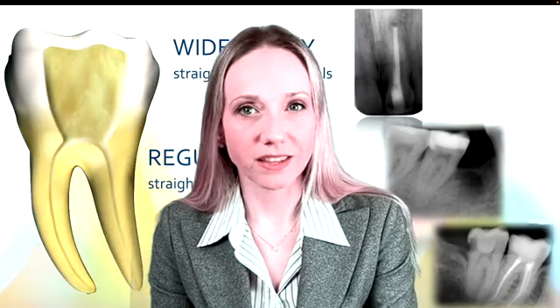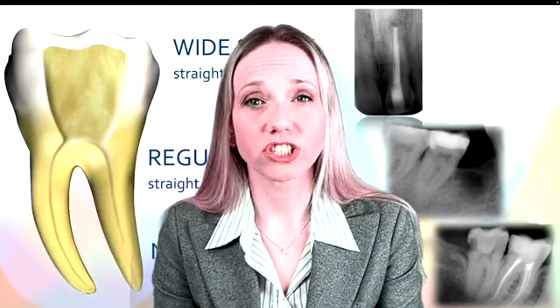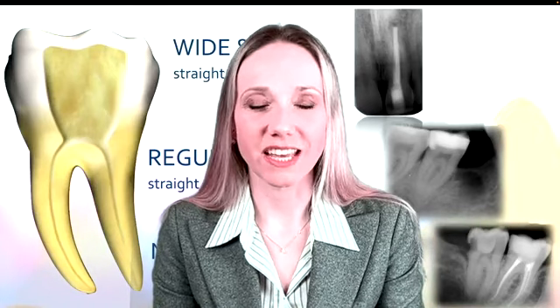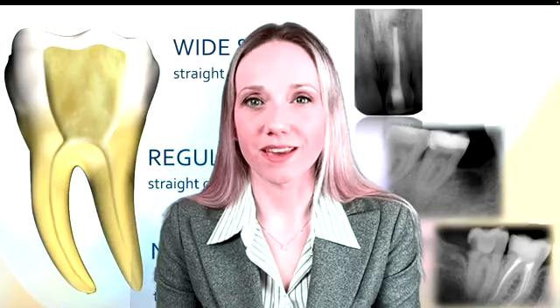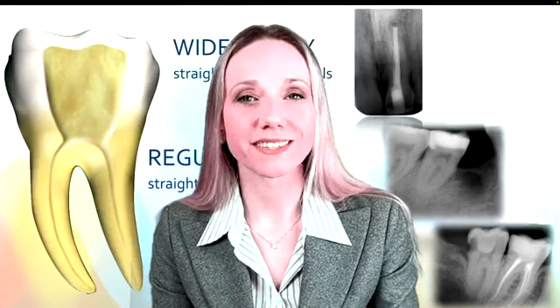in the outcome of our treatment and the outcome of our shaping, because we have to try to maintain as much as possible the original shape of the root canal in order to preserve the dentine. We always have to remember that yes, we do an endodontic treatment, but that tooth has to be restored later, and the more dentine we preserve, the better the outcome will be, and the restoration may be more conservative, so we can make an inlay or an onlay instead of a crown, for example. And this for our patients is vital, because in that situation we are buying time for their teeth to last longer in the mouth. So we are doing a service to our patient just by saving some dentine. This is something we always have to remember when we do an endodontic and restorative treatment.